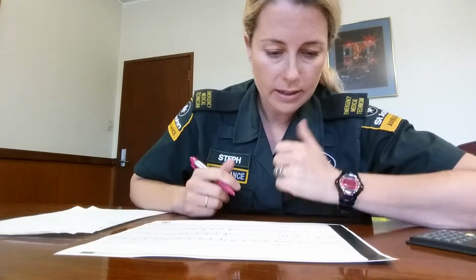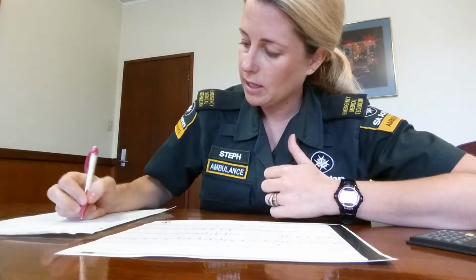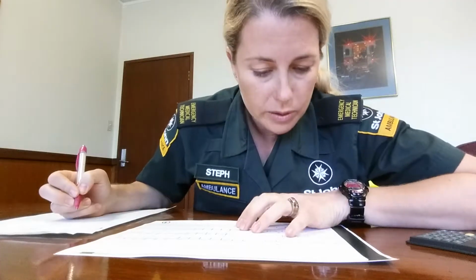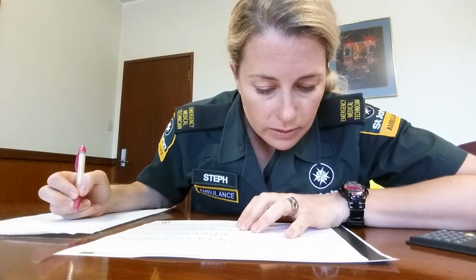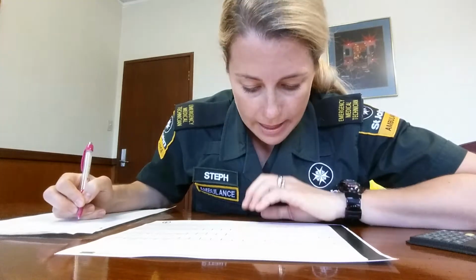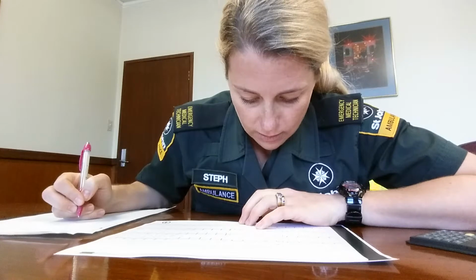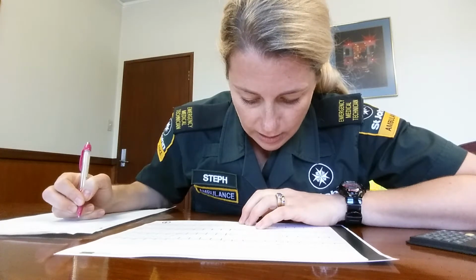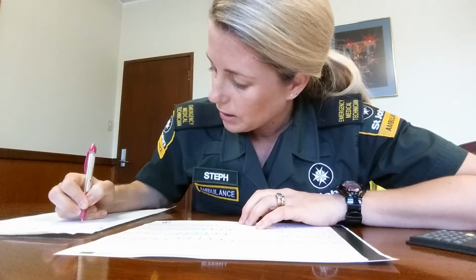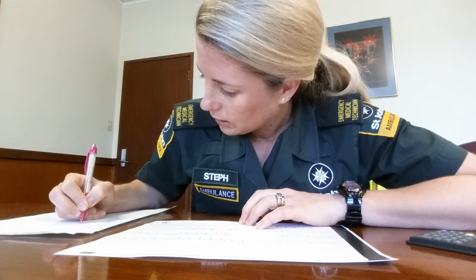No axis deviation. Lead 1 is positive by the thumbs method, and AVF is also positive, so I'm thinking normal axis, but we'll graph it out just to be sure. 1, 2, 3, 4, 5. So we've got 5 over to the right, and then AVF is 4 down, positive.